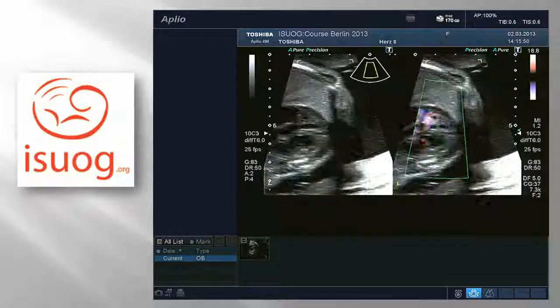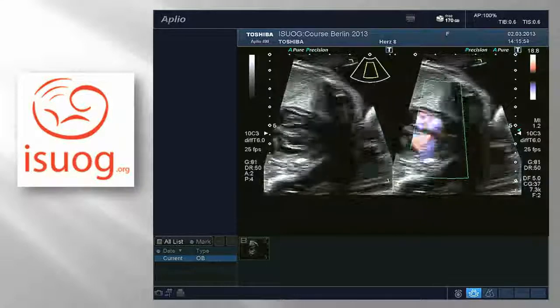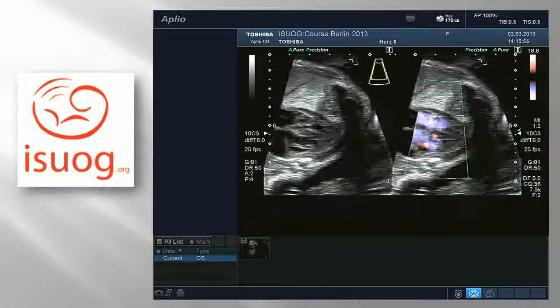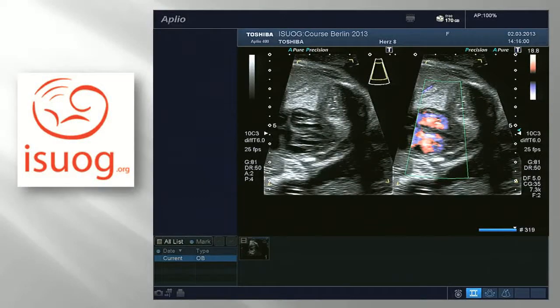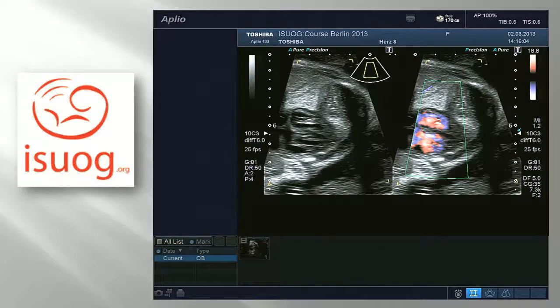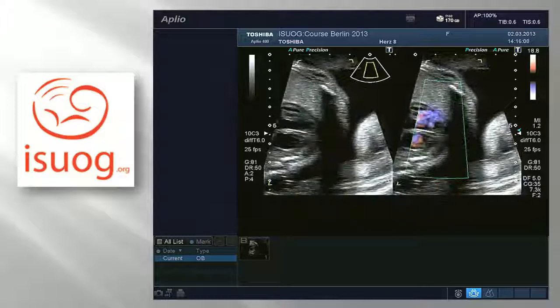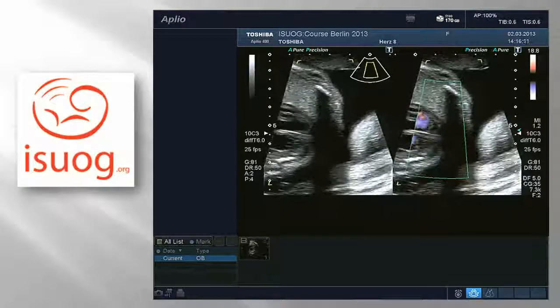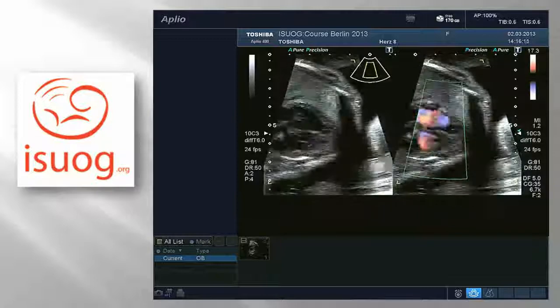To look at the ventricular septum, we're having a little bit of noise there. I need to clear that. So by filling the ventricles, it highlights the ventricular septum more clearly. Going all the way to the apex, and then I drop the velocity a bit more. Be careful not to drop it too much because we start getting artifacts.